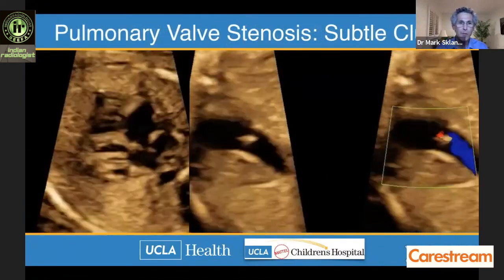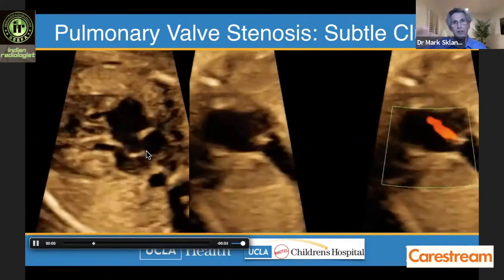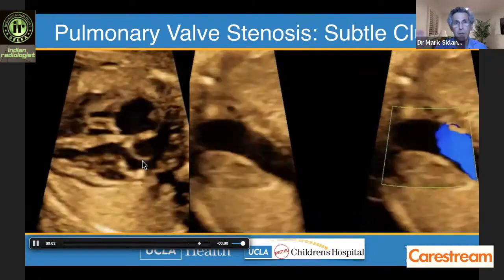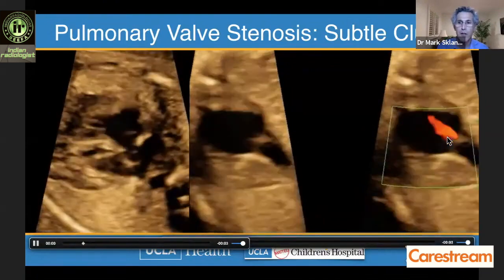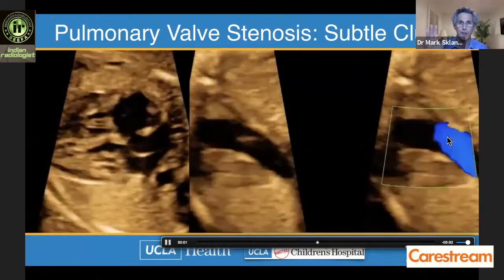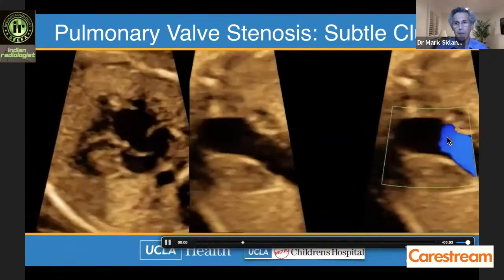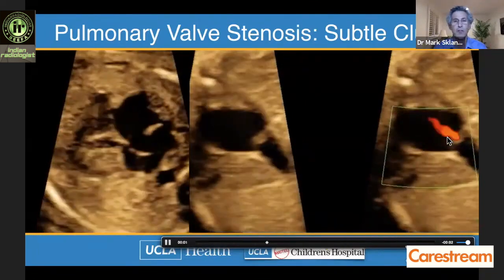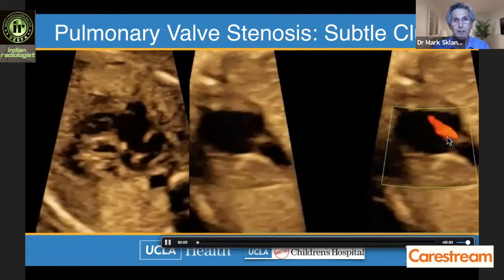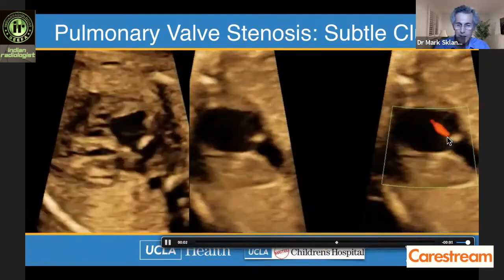Subtle clues for mild pulmonary stenosis include the atrial septum: increased RV afterload from pulmonary stenosis can elevate right atrial mean pressure, deviating the foramen ovale flap further into the left atrium than normal. Another clue is pulmonary regurgitation on color flow. Optimizing the color is critical to avoid false positives. If pulmonary regurgitation is present with an otherwise normal-appearing valve, follow-up is warranted, as these cases can progress to mild-to-moderate stenosis.